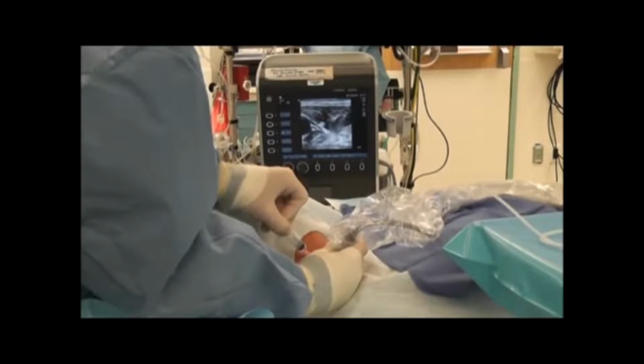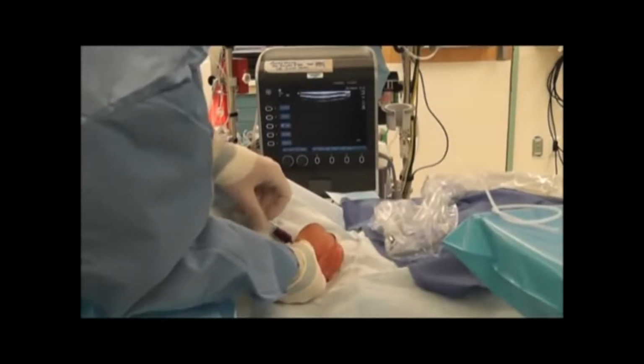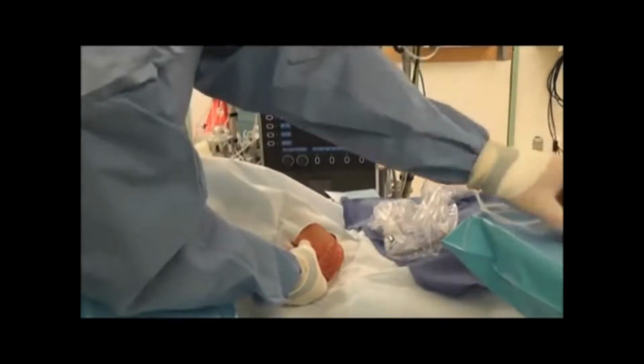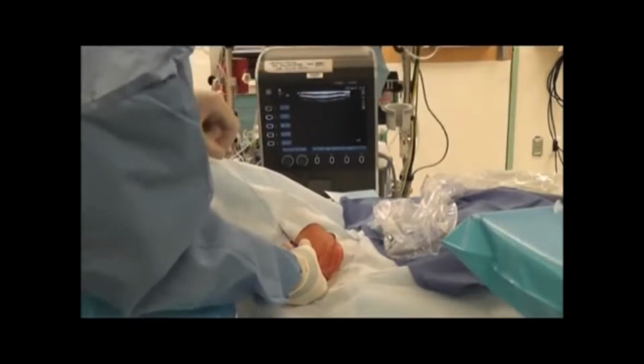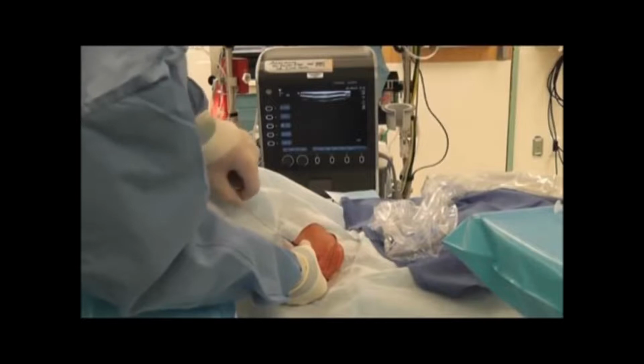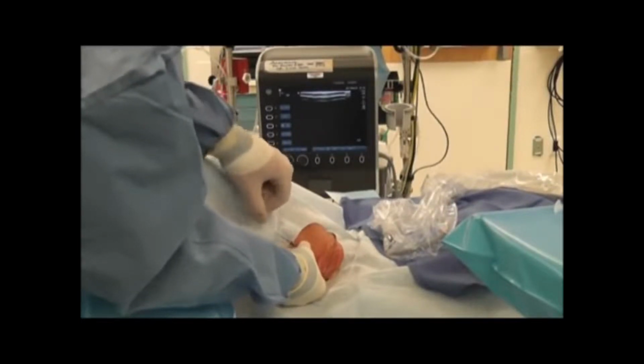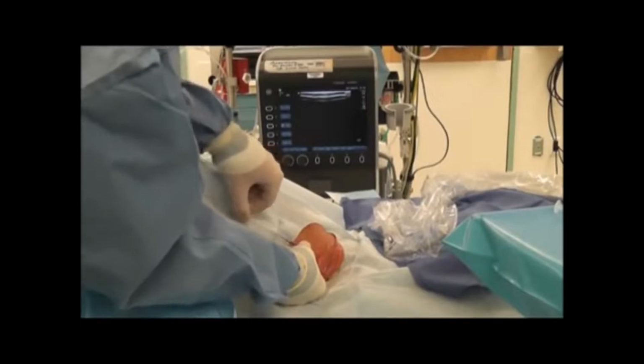There's always a risk. In this case, I went through the back wall. You can see that I pull back. Unfortunate, but sometimes the vein is too compressible when that happens. We got nice flow, and we advance our wire and this line. And the wire should go with zero resistance. And then the ultrasound should be used to confirm the position of the wire in the vein.